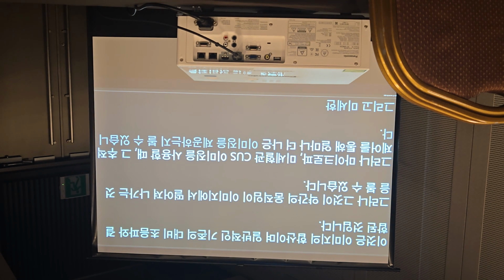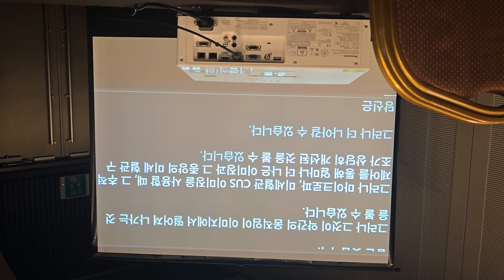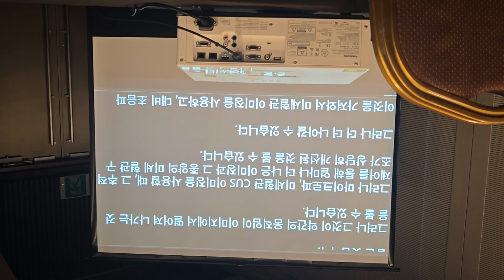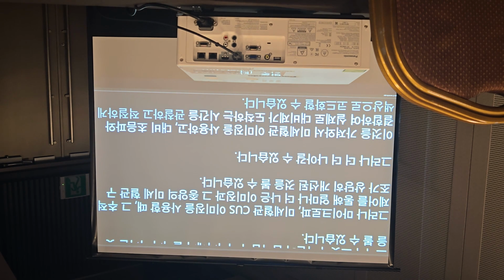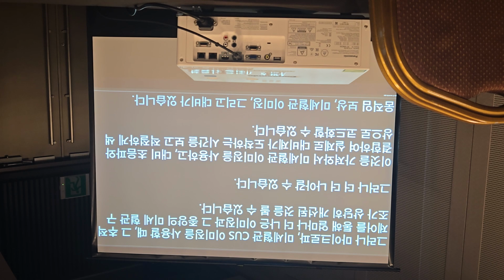But you can go even further. You can bring this in and use microvascular imaging combined with contrast-enhanced ultrasound, and you can actually then look at the time of arrival of the contrast as it comes, and color-coded appropriately. So you've got compensation of movement, you've got microvascular imaging, and you've got contrast there, and you've got time of arrival. But you can also then start using it in high resolution.